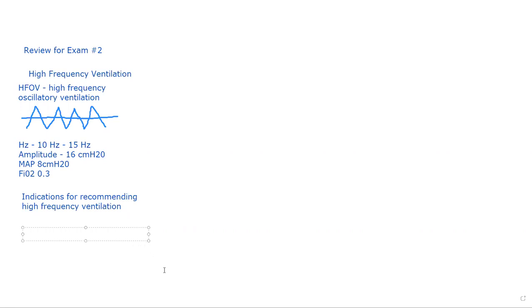What are different reasons for a fluctuating mean airway pressure? So if you have a mean airway pressure on an infant of, let's say you're at 12 centimeters of water, and you go in there and you look at the oscillator, now it's down to 10 centimeters of water, then it's up to 15 centimeters of water.